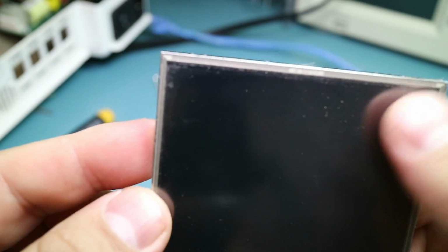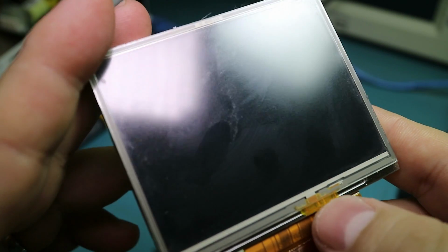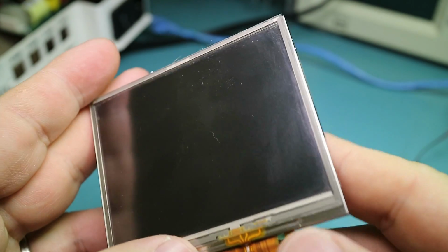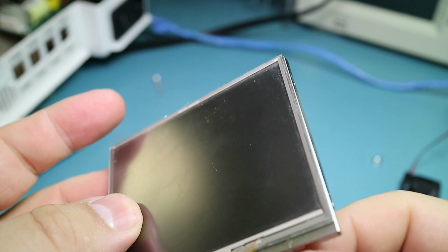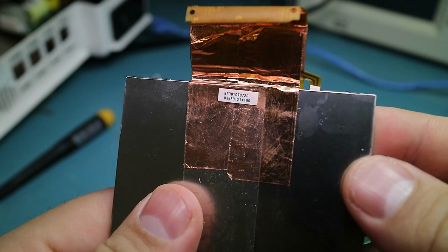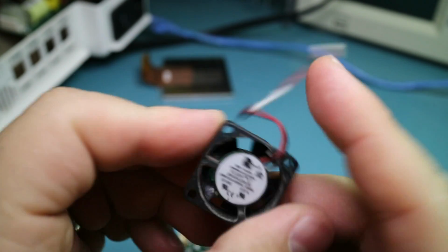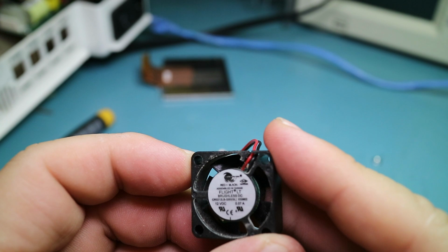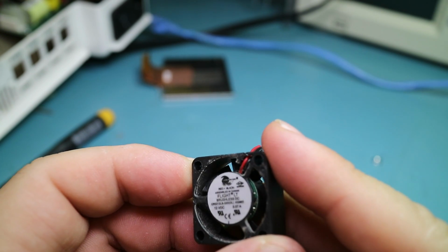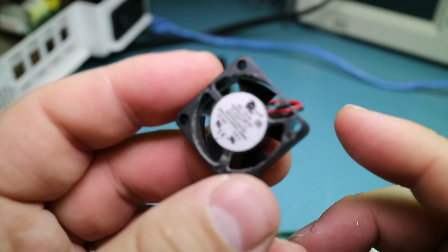This is the LCD module. It's kind of crusty, but you can see it's just a standard LCD with a small ribbon going to the touch sensor. And there's also a couple more wires going to the backlight. But yeah, pretty standard. It's just an LCD, and it's not very good. It's very low resolution. We've also got the fan, and the fan is a simple Flight LT, and it is 12 volt, and it is very, very loud. So I may hang on to this just because smaller fans are kind of hard to come by.